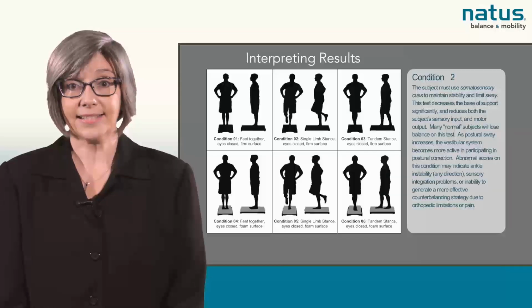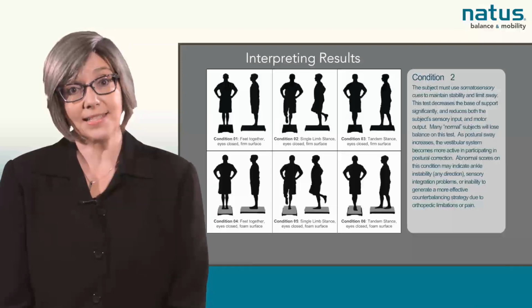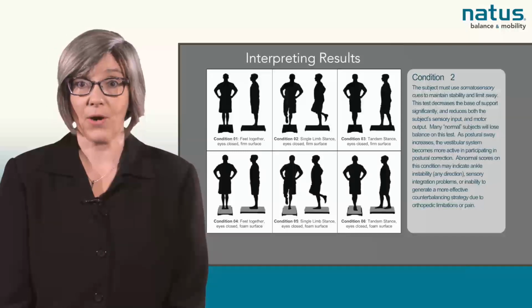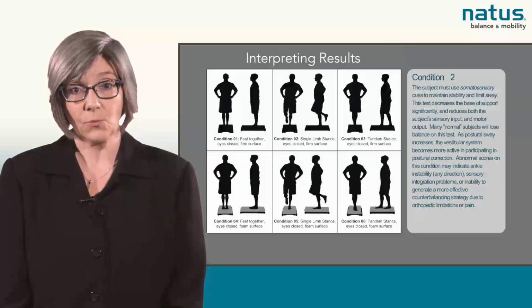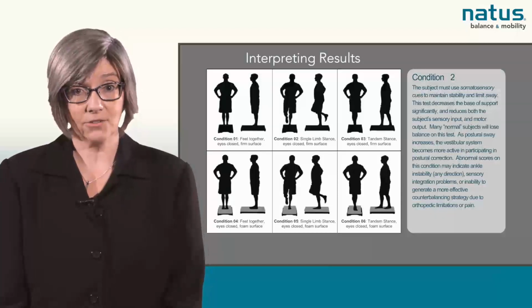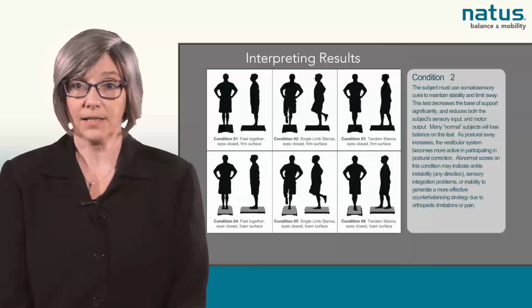Condition 2 is single leg stance on the non-dominant leg on a firm surface with the hands on the hips and the eyes closed. The patient must use somatosensory cues to maintain stability and limit sway. This test decreases the base of support significantly and reduces both the patient's sensory input and motor output. Many normal patients will lose balance on this test. As postural sway increases, the vestibular system becomes more active in participating in postural correction. Abnormal scores on this condition may indicate ankle instability in any direction, sensory integration problems, or inability to generate a more effective counterbalancing strategy due to orthopedic limitations or pain.